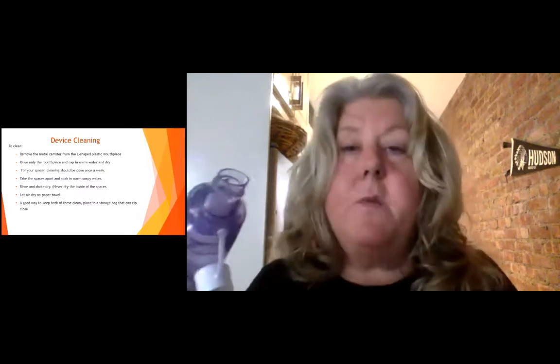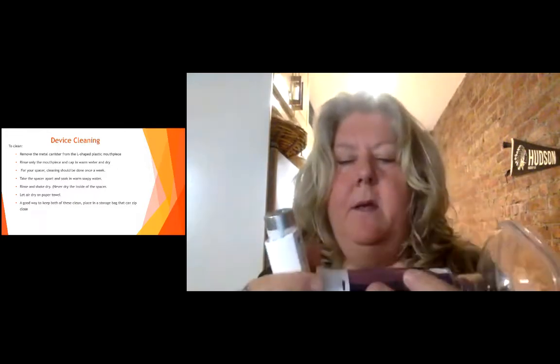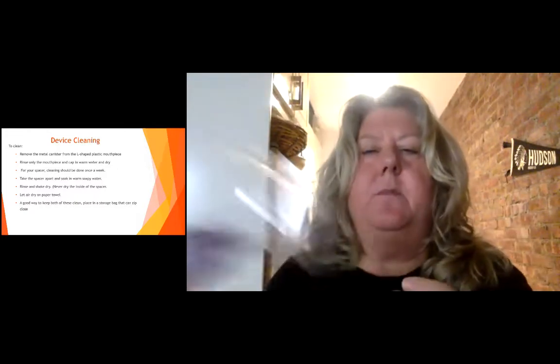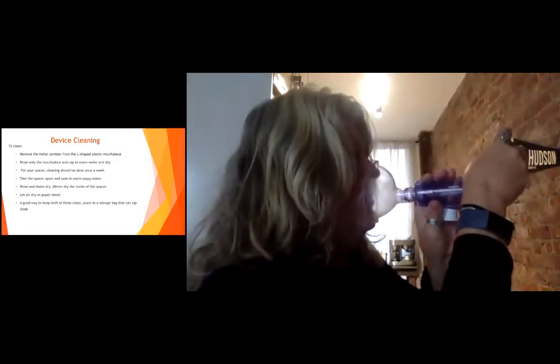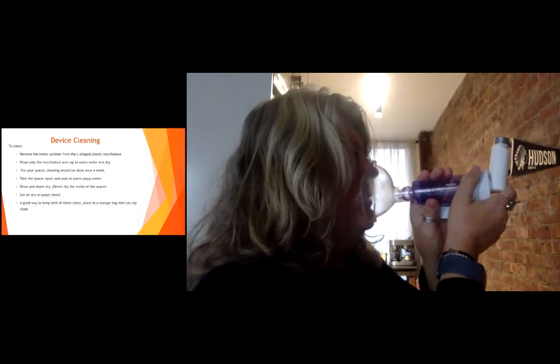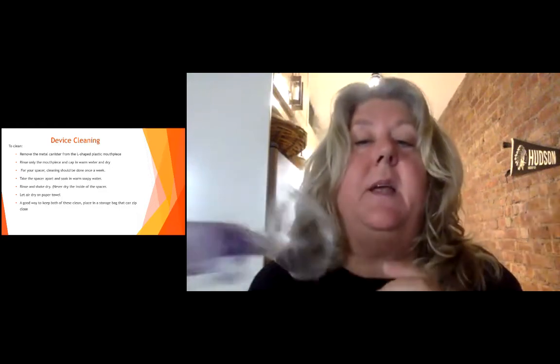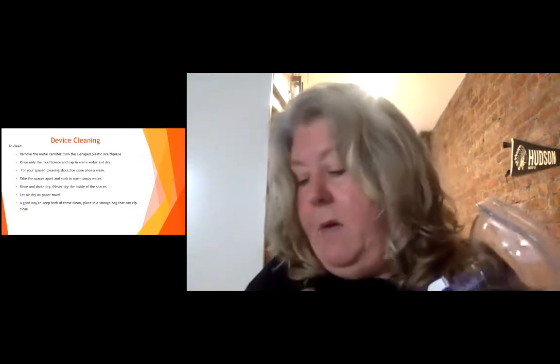All right. Next, we're going to use the face mask and show you with a face mask. Again, you're going to shake the medication up. You're going to make a nice tight seal. And you're going to breathe in and out for 6 times. Remember, always wait a minute in between puffs. And remember, always shake the medication up for the second puff. All right, good. Now we're going to go to the device cleaning.